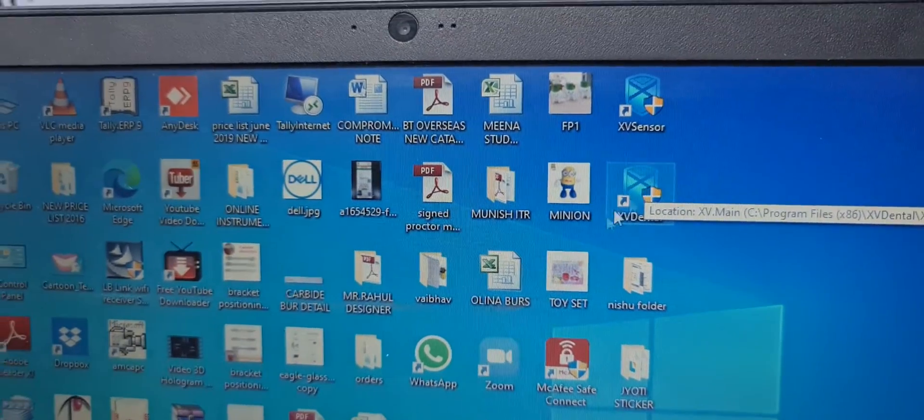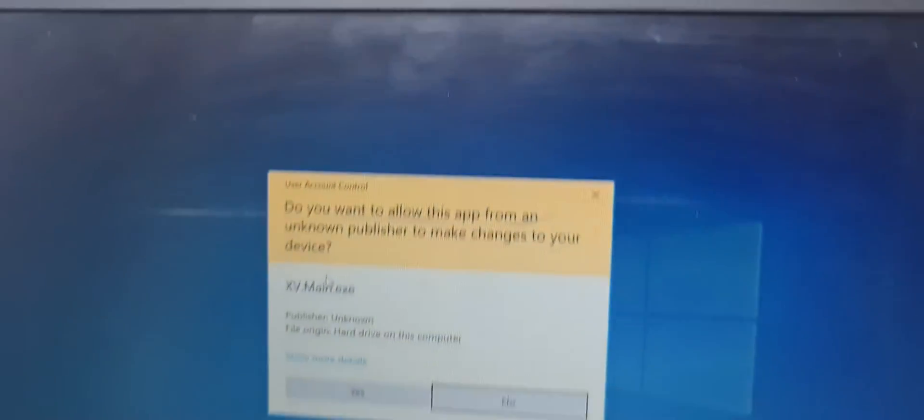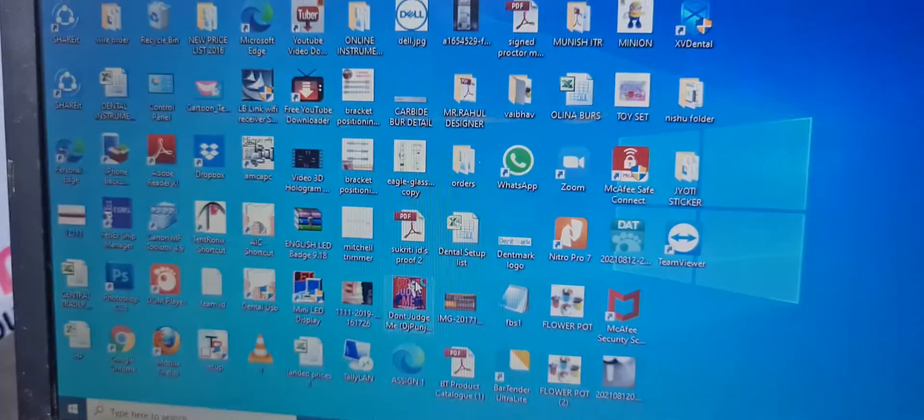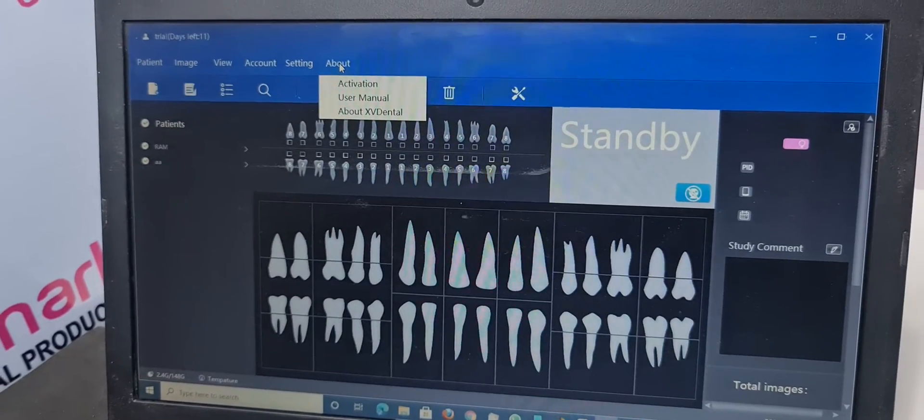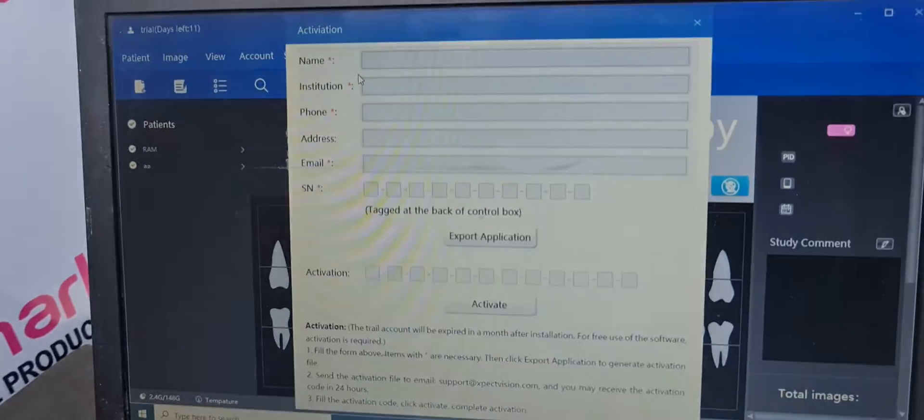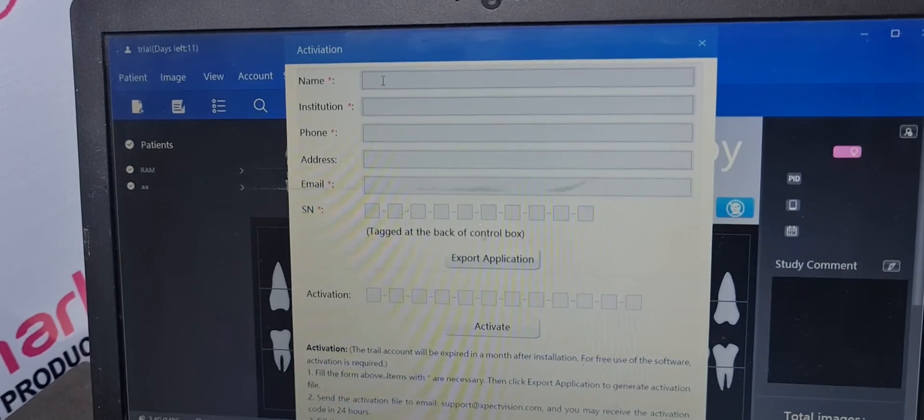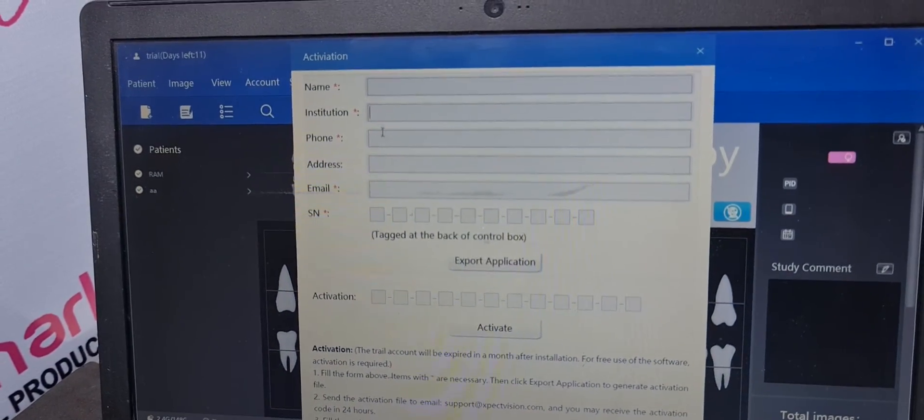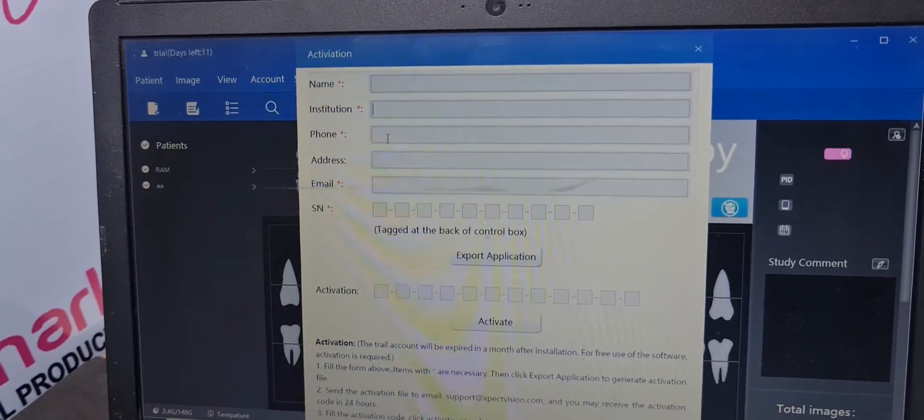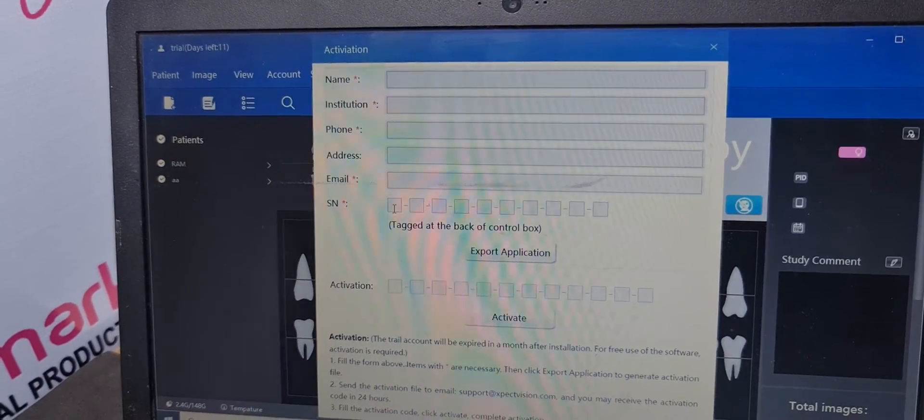You can press the XV dental or XV sensor which software comes. First of all, you have to activate. In the activation, you can write name, institution, if you want to write phone, address, your email, ID and the serial number.